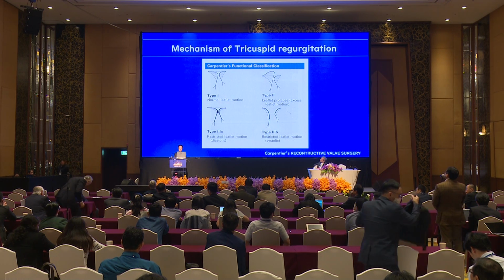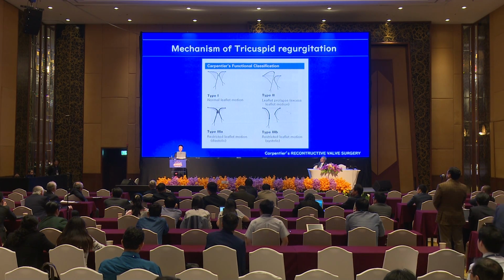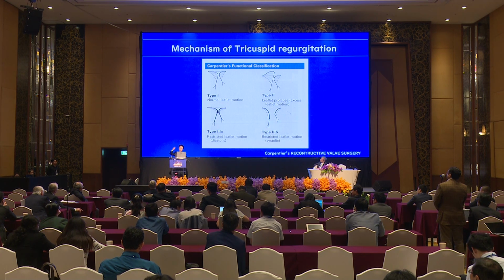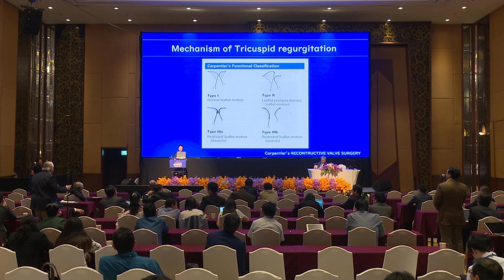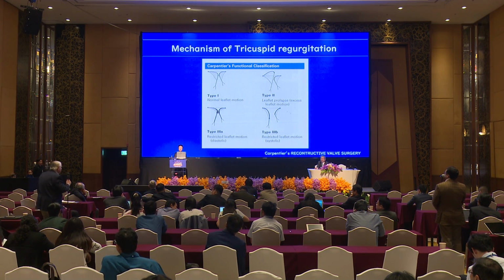And then Professor Aishi at Nagasaki University in my country has a spiral technique to suture the anterior leaflet towards the septal annulus. I think it's a very, very good technique, but sometimes the papillary muscle is a little bit thinner and weaker than we expected, and then it may be tricky. But I think it's certainly one option.